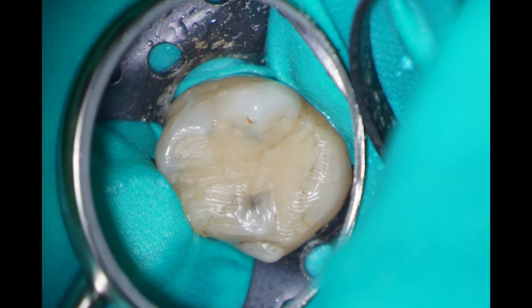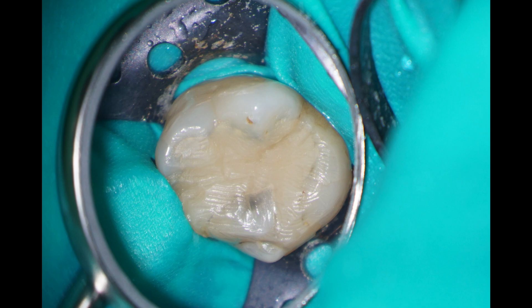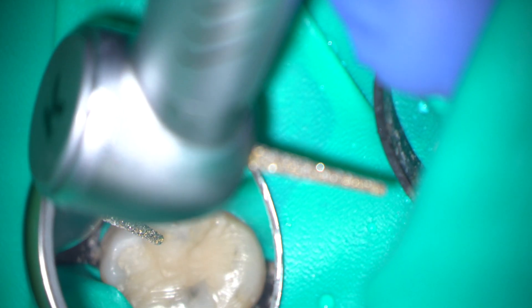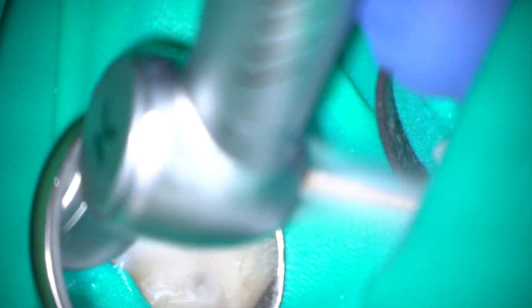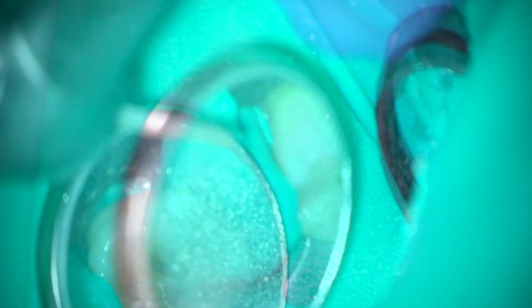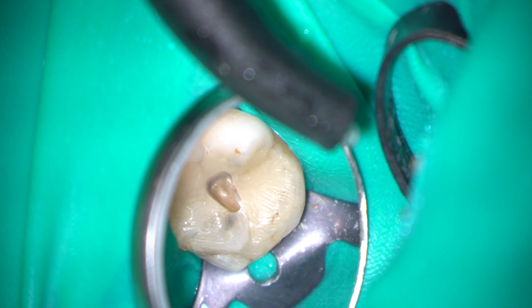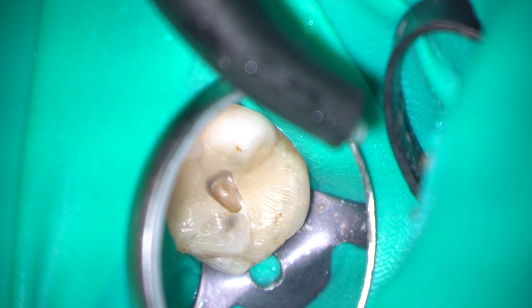Here you can see the tooth isolated with a non-latex rubber dam and a Hue 3D black series number 14 clamp. I'm making an access cavity using a long tapered diamond burr and at my first attempt I don't penetrate the pulp chamber.